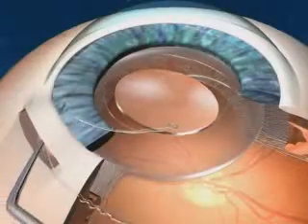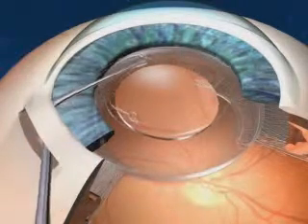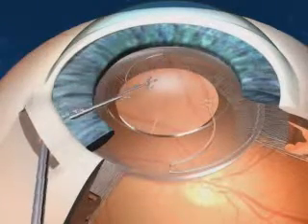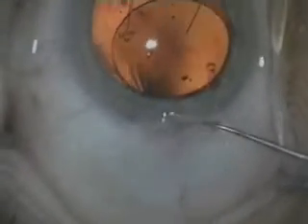Before inserting the trailing haptic into the capsular bag, please ensure that the anterior chamber and the capsular bag contain sufficient viscoelastic solution. The trailing haptic can now be rotated into the capsular bag using a Y hook. Place the tip of the instrument on the inside of the elbow of the trailing haptic and push the haptic through the incision and rotate into the capsular bag.